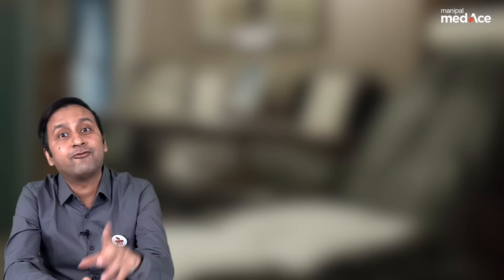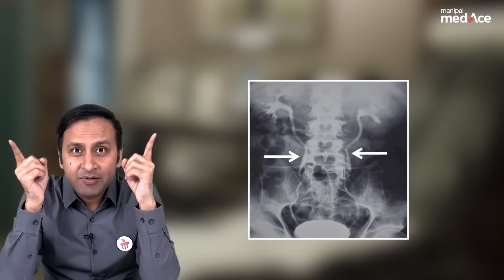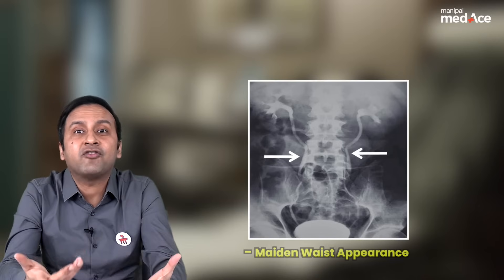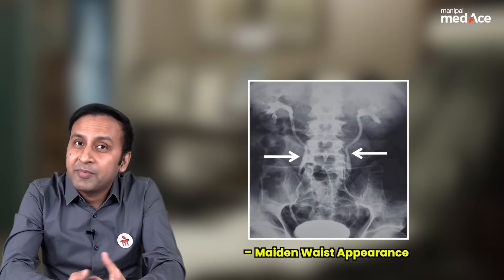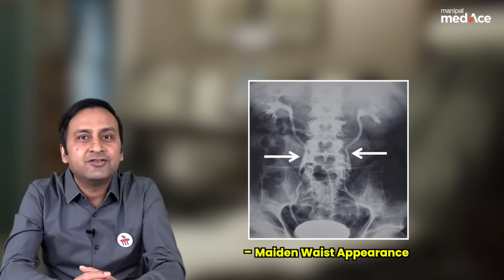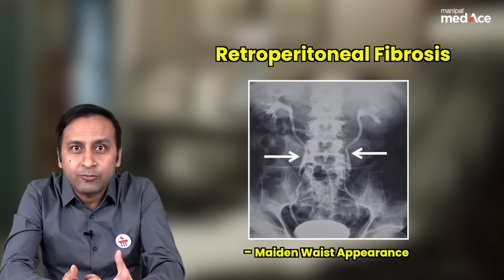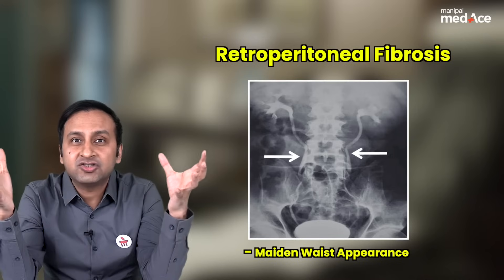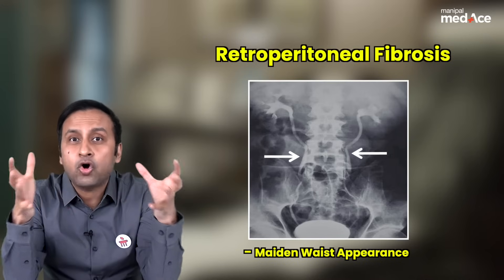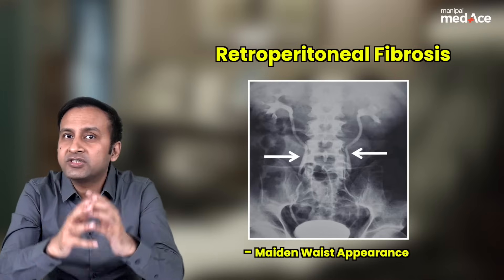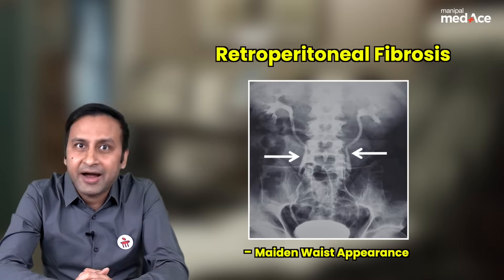Let's talk about our fourth case. In this IVP image, both the ureters appear to have been medially deviated, just like the waist of a maiden. This maiden waist deformity is seen in a condition called retroperitoneal fibrosis, where the fibrotic reaction causes medial deviation of both ureters and is usually associated with upstream hydronephrosis.